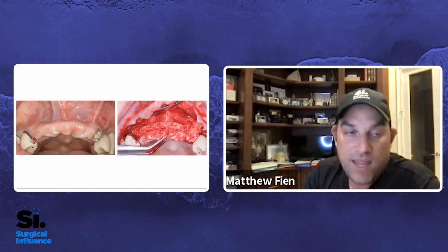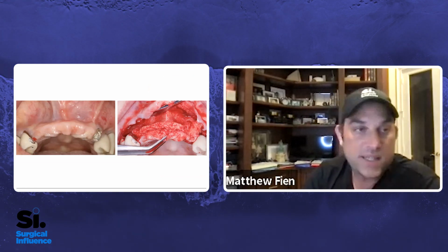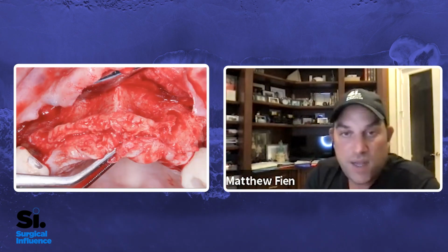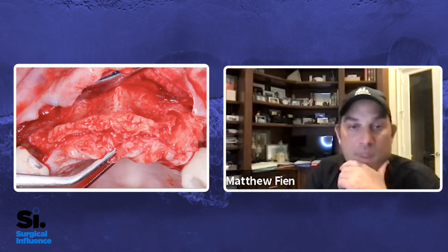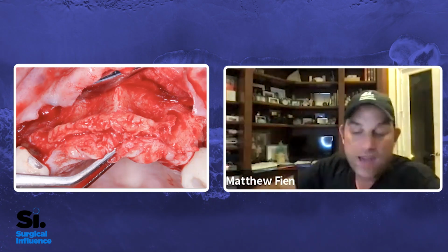But in the anterior, I'm really more prone now to using some sort of stability device like a tack or a screw. And similar to how Israel used the d-PTFE, I'll do the sausage technique. And one of the most challenging things of these is that large curvature. How do we manage that large curvature?